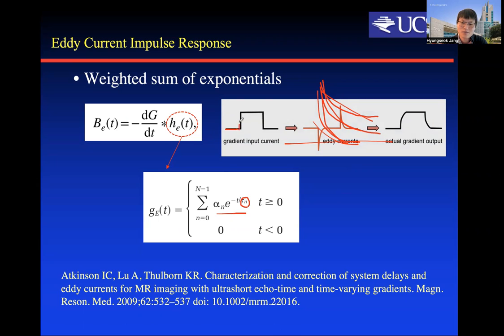And then this one changes in the positive direction, right? And then say that this is the impulse response. Then we get this kind of eddy current, right? So you see that this is always in the minus direction, the opposite direction. And after that, when it's ramped down, then a current is generated in a shape like this.